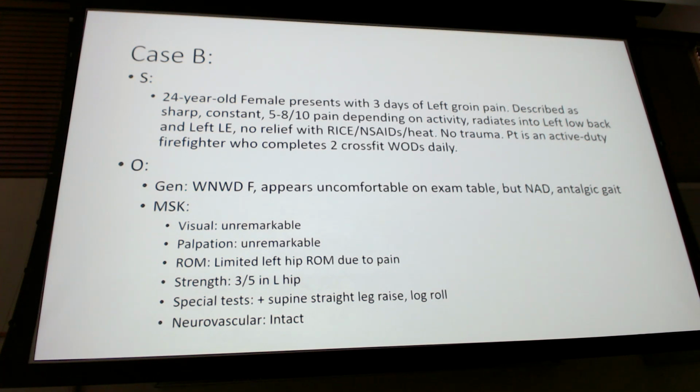If you notice when you looked at our elbow X-rays, almost all of our elbow X-rays were just the elbow. I didn't have the wrist or the shoulder, and that's okay. But if you're concerned about mid-humerus or mid-radius ulna, and you're getting the bone, that's where you need both. And that's where instead of a hip X-ray, I would be ordering a femur X-ray. Good question.